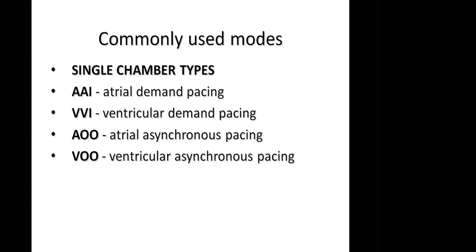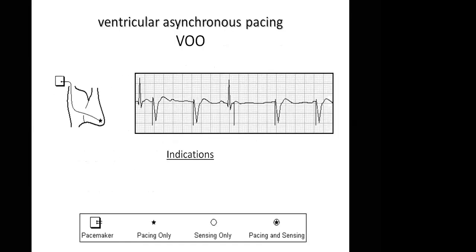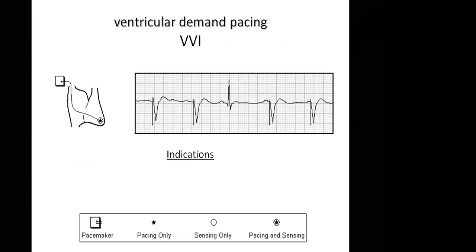Dysfunctional in the sense that if you don't put a lead in the atrium... So I'll go into this one now. I'll show us this. We can see this now. This is a VVI mode, right? Yes, sir. You put a lead in the ventricle, but there's no lead in the atrium, probably because the patient has multiple P waves that are not conducted, right? Yes, sir.